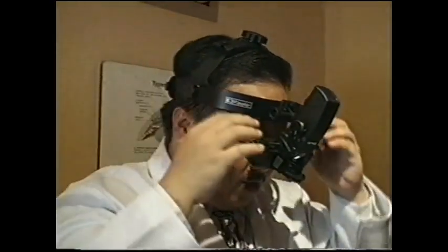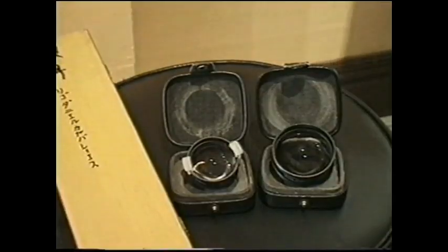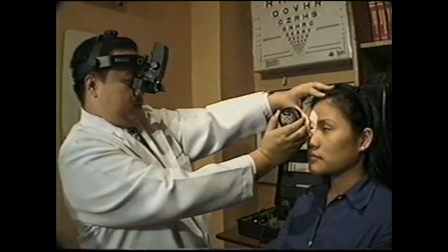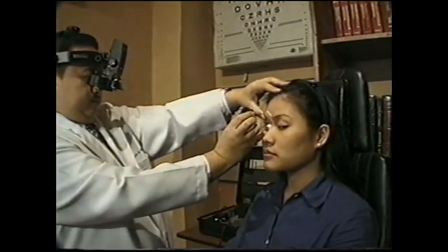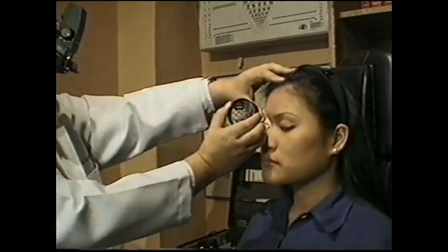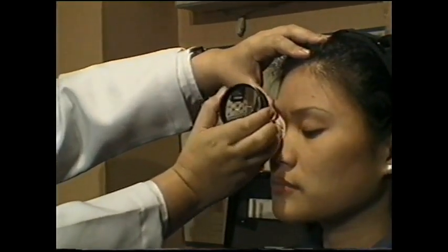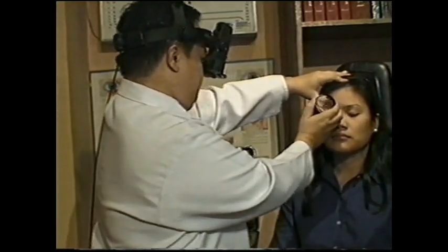The indirect ophthalmoscope consists of a headset with a binocular viewing device that optically reduces the examiner's interpupillary distance and an adjustable lighting system wired through a transformer power source. The examiner positions a variety of convex handheld lenses called condensing lenses close to the patient's eye. From an arm's length distance, the examiner examines the patient's fundus, preferably through a dilated pupil. The indirect ophthalmoscope provides a stereoscopic wide field of view, 40 to 50 degrees, allows examination of the retinal periphery, and makes it possible to penetrate hazy media.